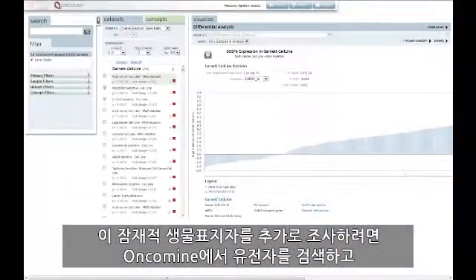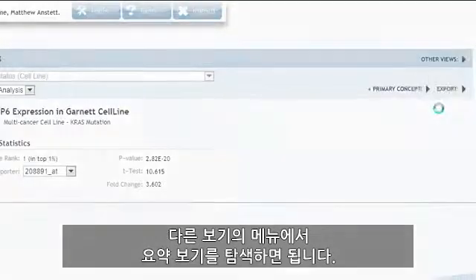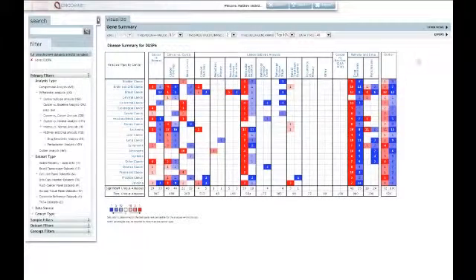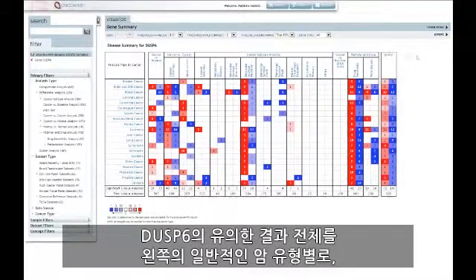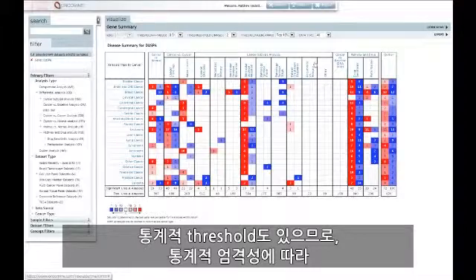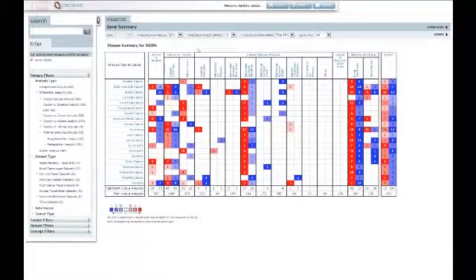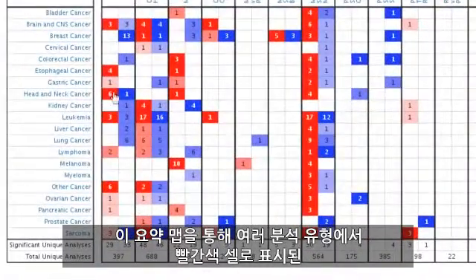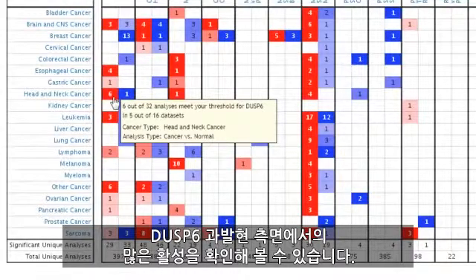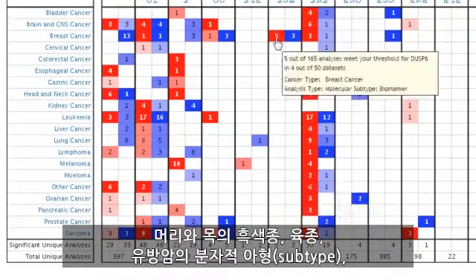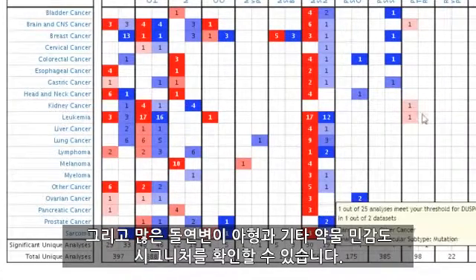Now that we've identified DUSP6, we can further investigate this potential biomarker by performing a gene search in Oncomine and navigating to the summary view from the other views menu. In our summary view, all of the significant results for DUSP6 across all the Oncomine analyses are shown by general cancer type on the left and by analysis type on the top. We have a statistical threshold that we can adjust to show fewer or more results depending on statistical stringency. From this summary map, we see quite a bit of activity in terms of overexpression of DUSP6, shown in red cells, in multiple analysis types — head and neck, melanoma, sarcoma, molecular subtypes in breast cancer, and in a number of mutation subtypes and other drug sensitivity signatures.